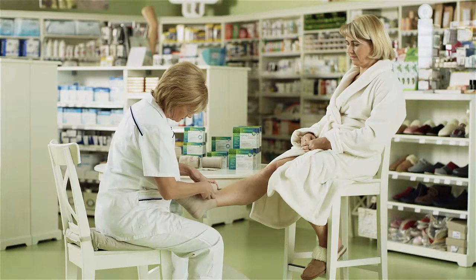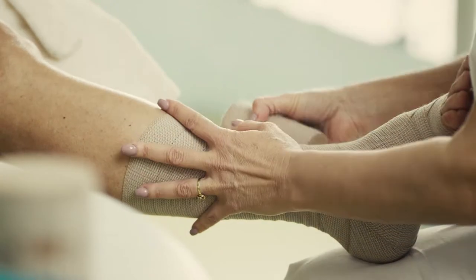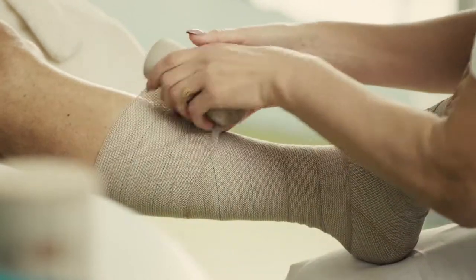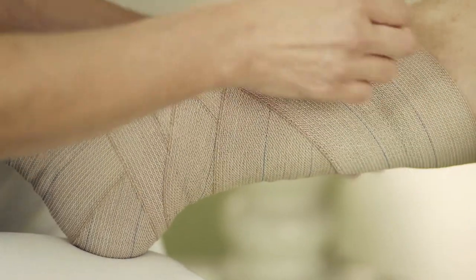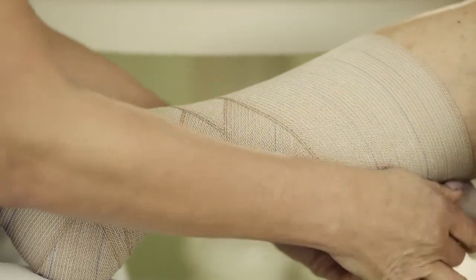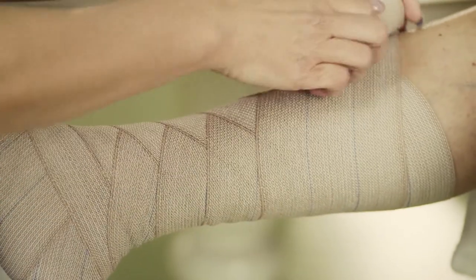Continue with wrapping towards the knee. Begin with a uniform, moderate tension of the bandage by placing it on the skin in the shape of the number eight. With this method, we can achieve the optimal fit of the bandage. Note that the spacing between wraps is even. The pressure should be uniform over the entire shin.